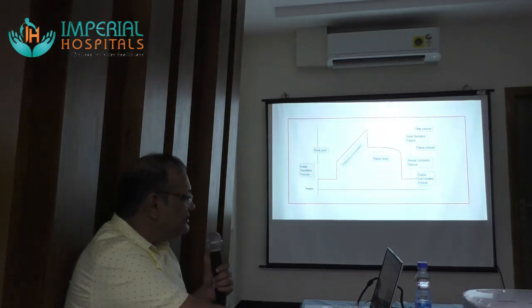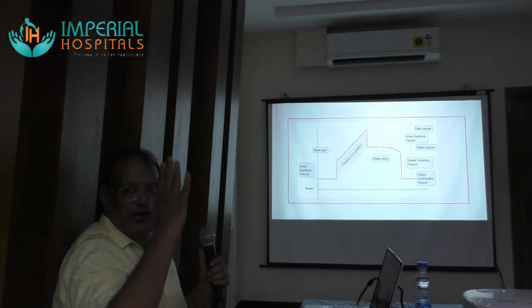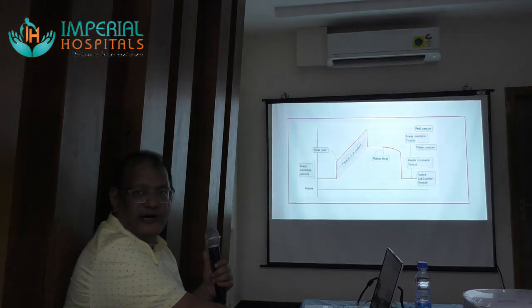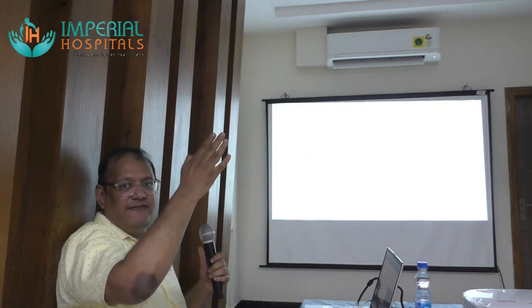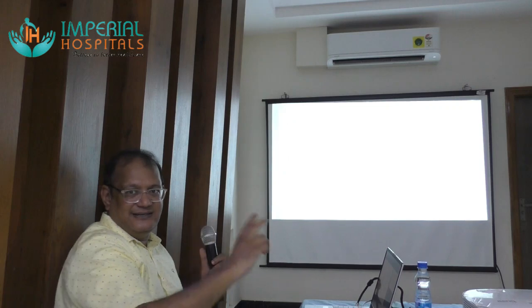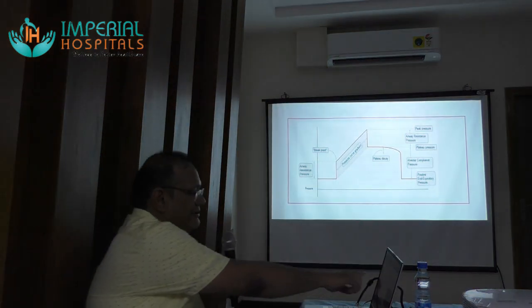So in this, you see the first part, right, where there is almost a square pattern rise, like a 90 degree rise, and you'll see a point noted as the break point. So why do you see a sudden sharp increase followed by a gradual increase? This sharp increase is to overcome the airway resistance, right? And you'll see a similar thing at the end.